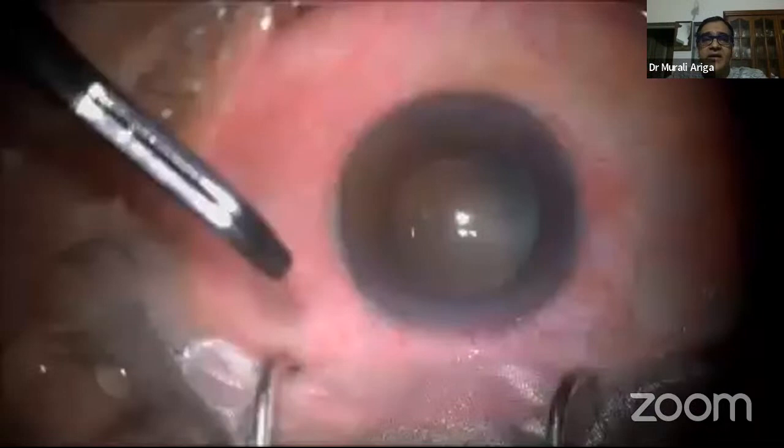Allow the iris to prolapse and cut it parallel to the limbus so that you avoid cutting the iris jagged. There's a simple technique of cutting the iris. Maybe the video could show that. Okay, we are just showing.